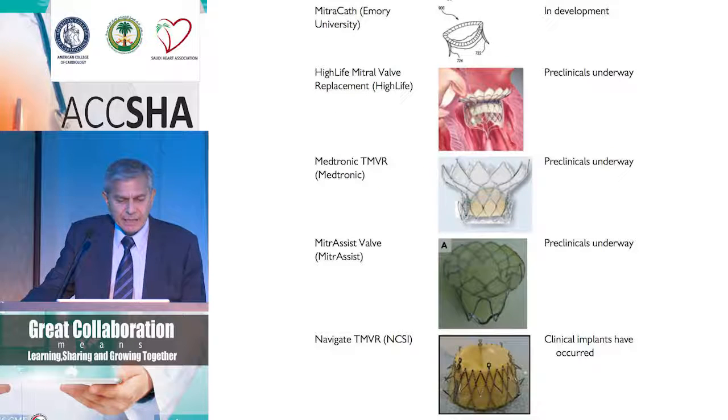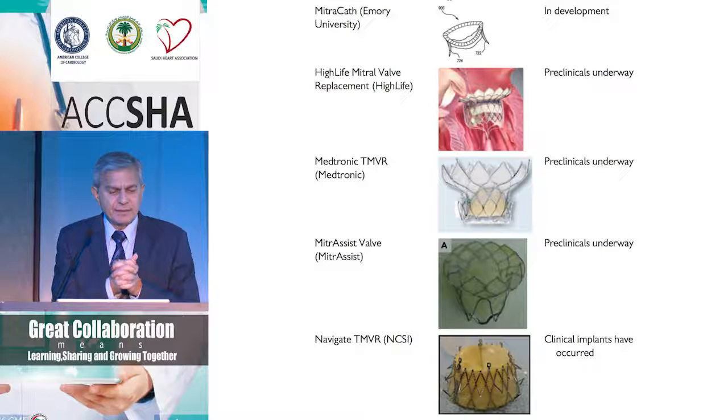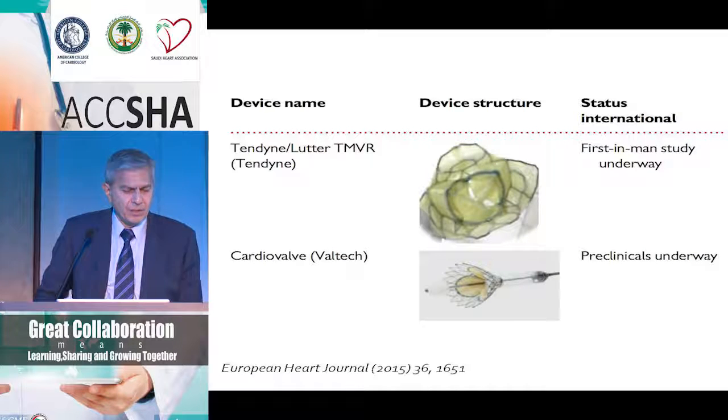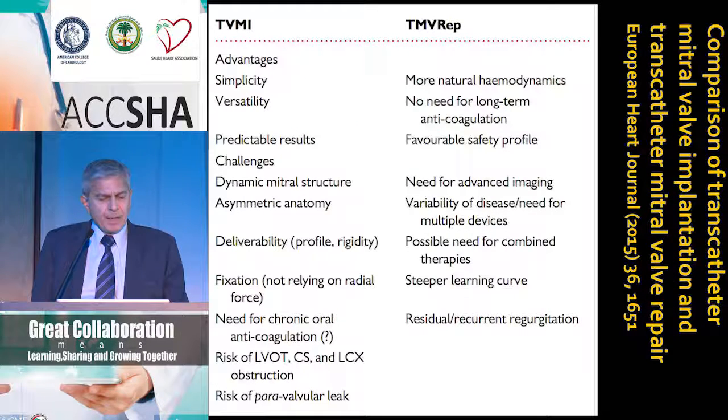And this is my last slide, just to kind of tell you, for example, what are the expected advantages or disadvantages of the transcatheter valve implantation versus the repair. The implantation, the advantages, if the technology becomes quite refined, it may become simple compared to the difficult technology that I showed you in those videos. It may be more versatile and it may give you more predictable result.